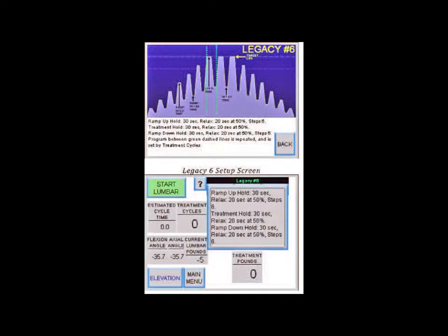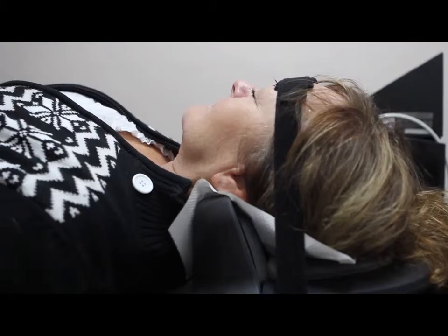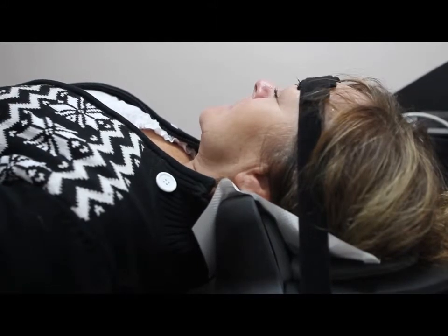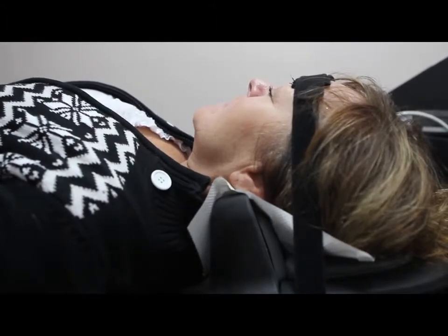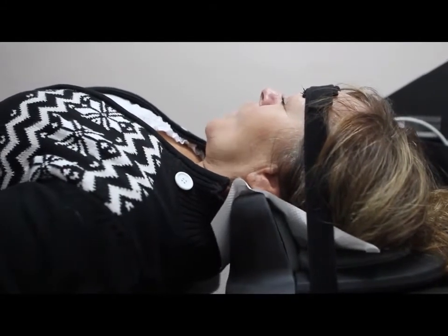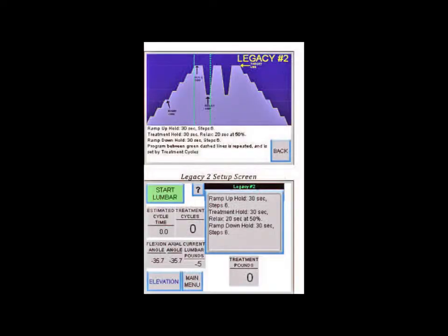If this is one of the patient's first few visits, usually start with Legacy Program 6 and choose the number of cycles that will give 15 minutes of decompression. After 3 visits, change to Legacy Program 5 and choose the cycles that give 18 minutes. As far as the weight is considered, usually take 1/10 of the patient weight or a minimum of 15 pounds of decompression. After 3 sessions, increase it to 18 pounds, 18 minutes. And after that, to 20 pounds, 20 minutes, Protocol 2. And finally, 22 pounds, 22 minutes, and Protocol 1.